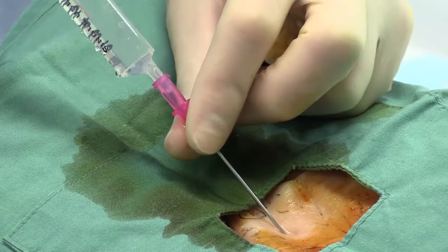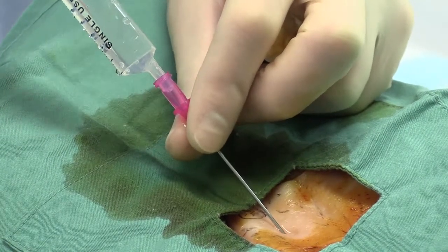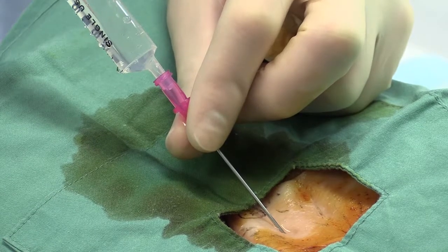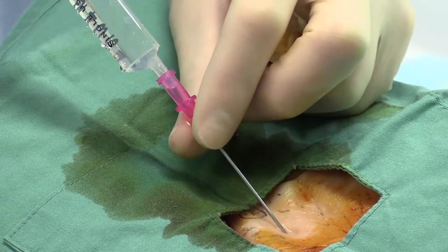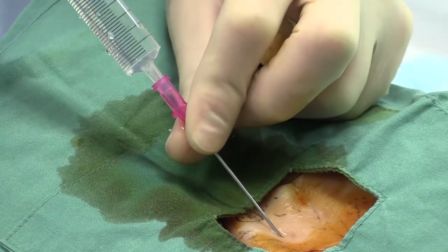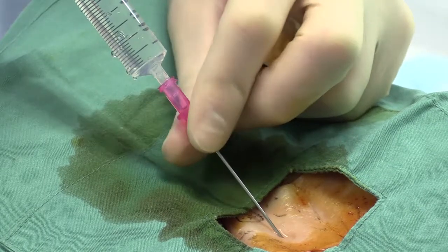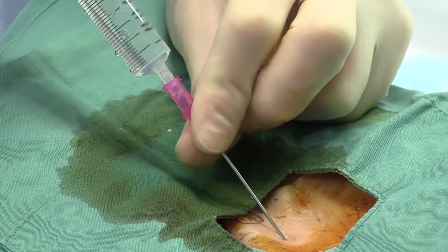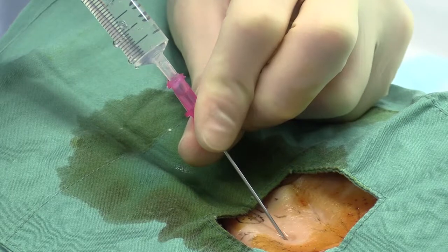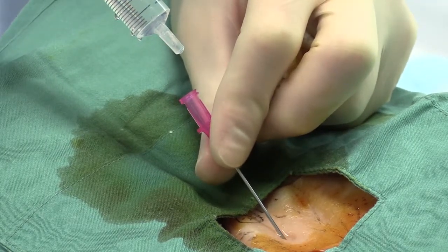Having excluded air, blood, or bile, enteric contents, usually demonstrated by particulate fluid or bilious fluid, then one can use a trick to see if the column of fluid you're injecting into the hub of the needle continues to move down the hub of the needle, suggesting that you're in a potential space, as demonstrated there.